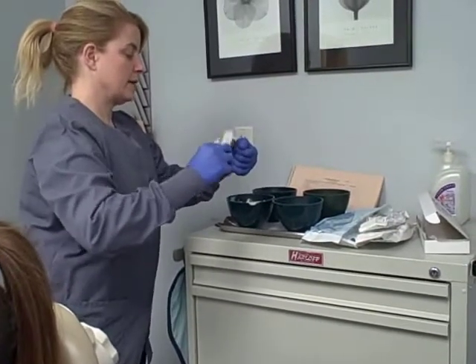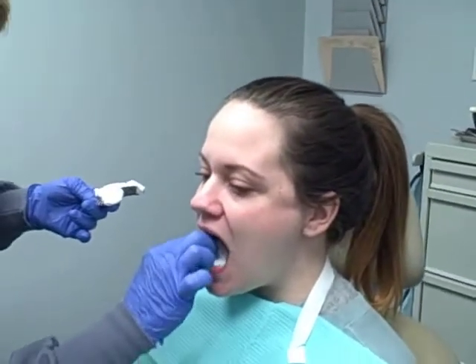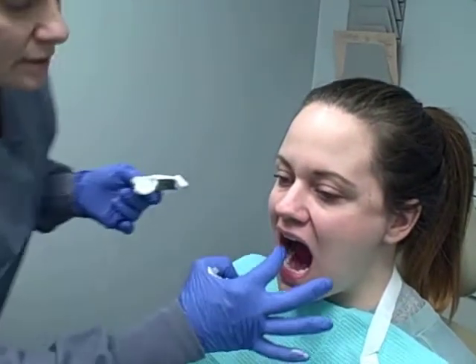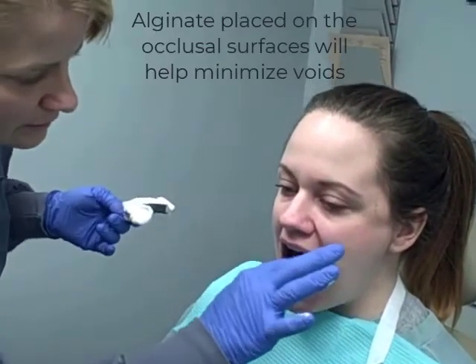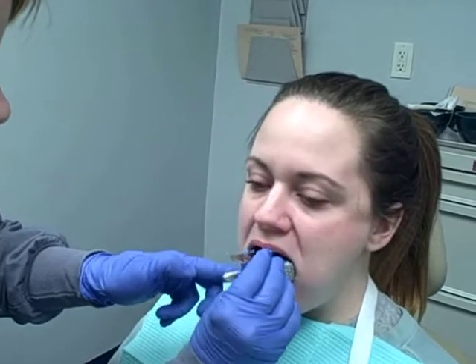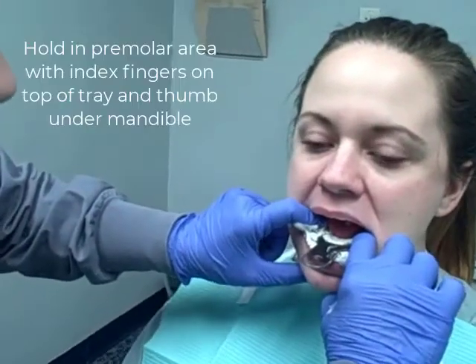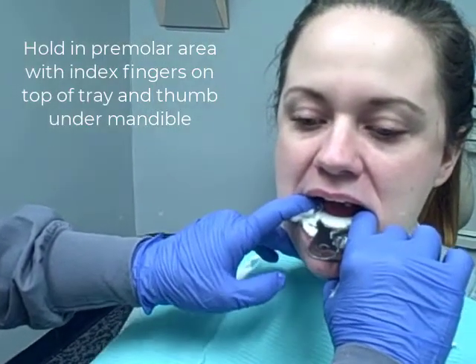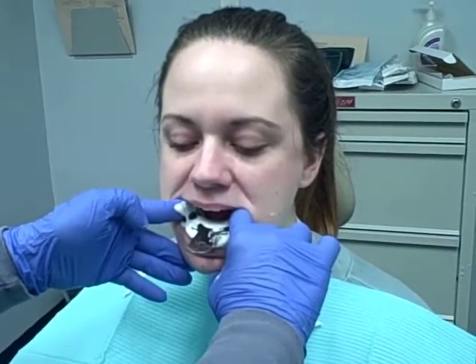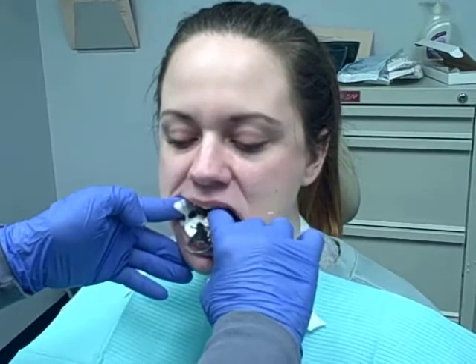We have to remember to dry the teeth off first. So I'm going to use my gauze to dry the teeth off. And I'm going to add just a little bit of extra alginate to the occlusal surface. Then put the tray in. Lift your tongue through your mouth, kind of get it in position, and then we're holding it in there for about a minute. You want to be sure to hold it in place so that if they swallow, it doesn't make the impression rise up and distort it.